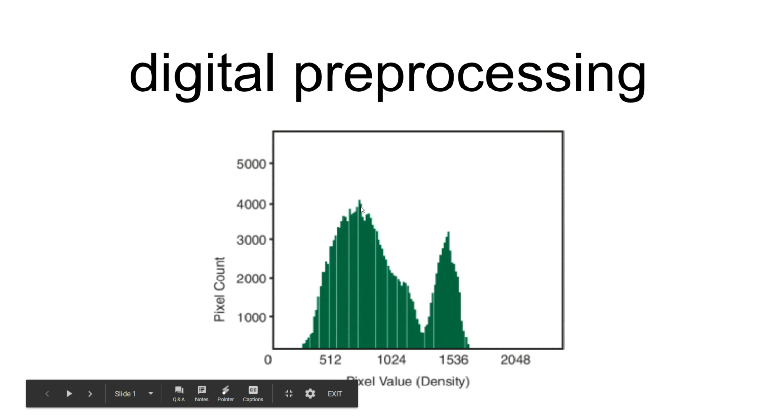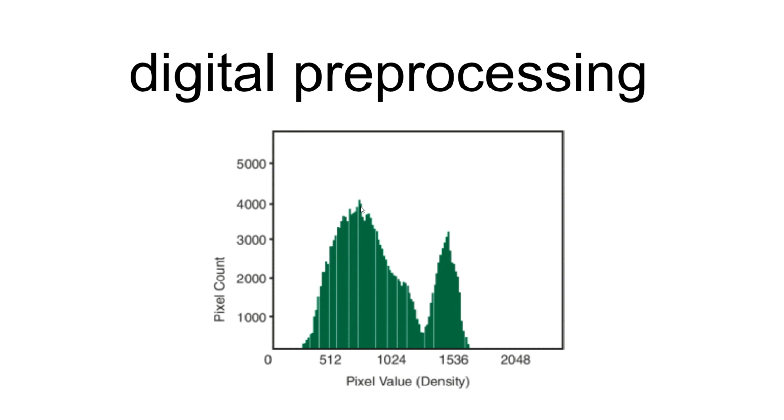And the idea is that the histogram that the computer has, which goes by a specialized name called a lookup table, is going to compare what it thinks is optimal compared to the histogram that was created by your exposure, by your raw data. So that's kind of the whole story.